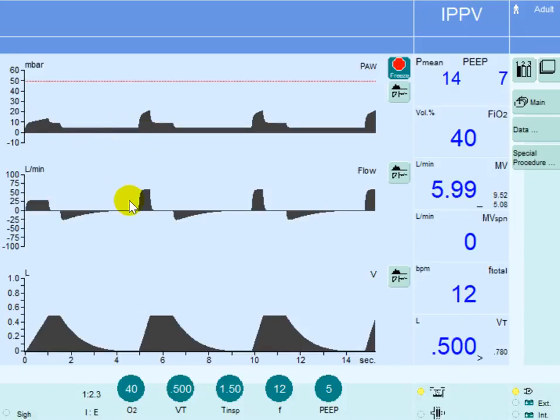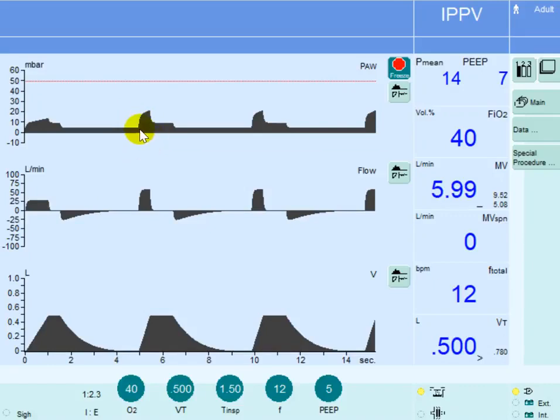At the same time, notice that the peak pressure is increased. The peak pressure is increased because of the increased airway pressure. Remember, the pressure needed to be applied on the ventilator circuit is equivalent to the flow multiplied by the resistance, plus tidal volume divided by compliance — this is the equation of motion. So the higher the flow, the higher the airway pressure required to get that air inside the lung.